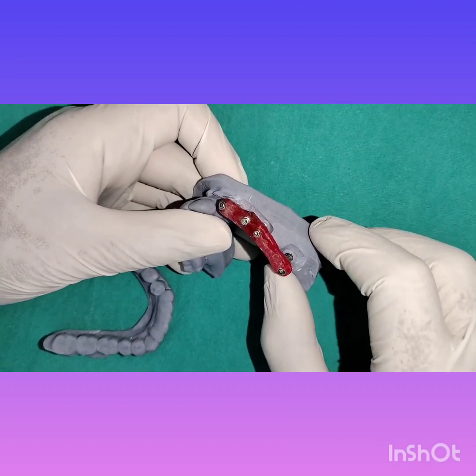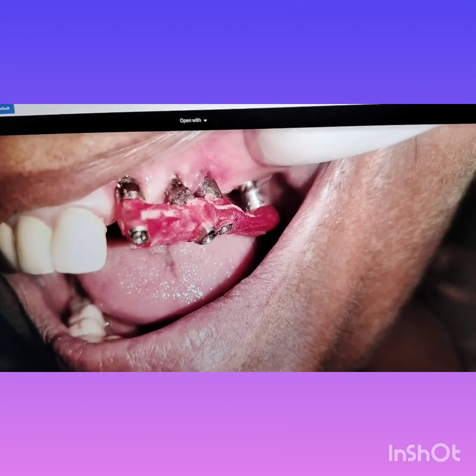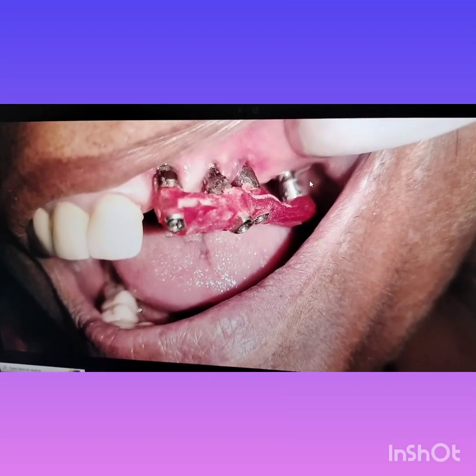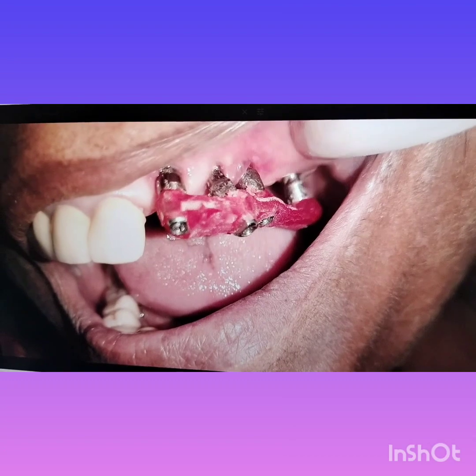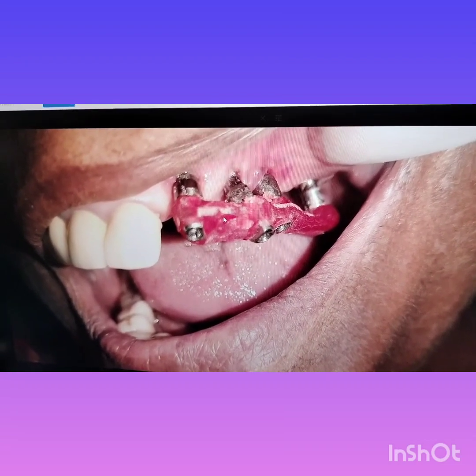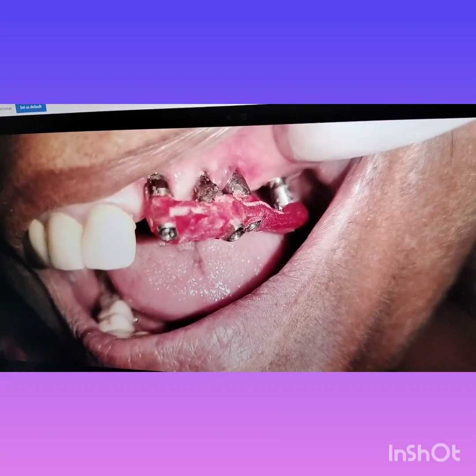In the patient's mouth, make sure you have good contact of the impression coping into the implants. Place and remove them in the same manner as shown on the digital model and the 3D-printed model. Also confirm the placement by taking an x-ray to be sure the positioning of the impression coping is correct before proceeding with fabrication.